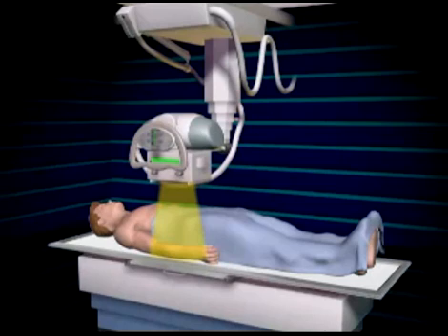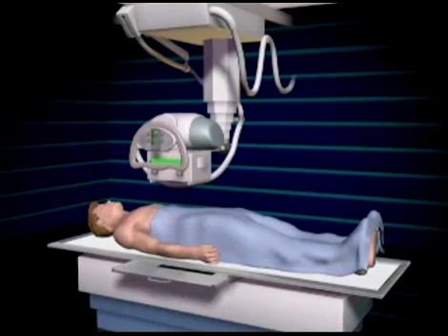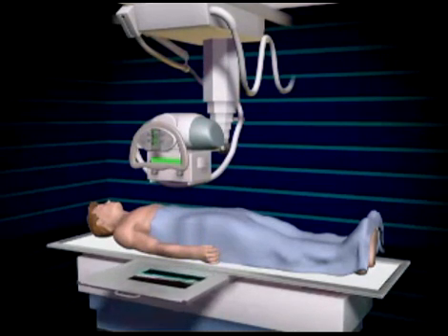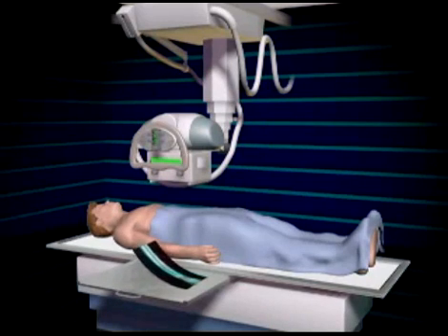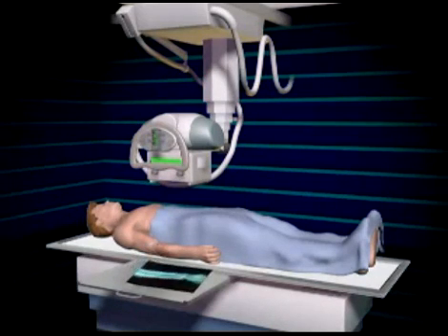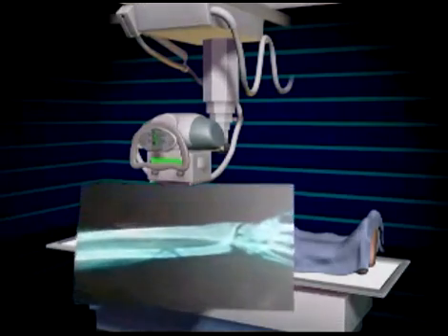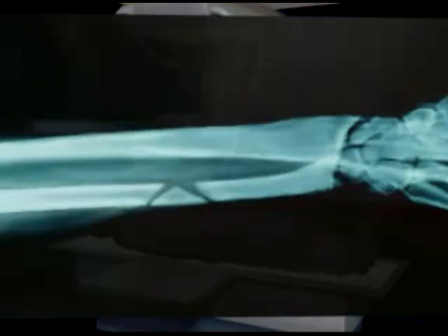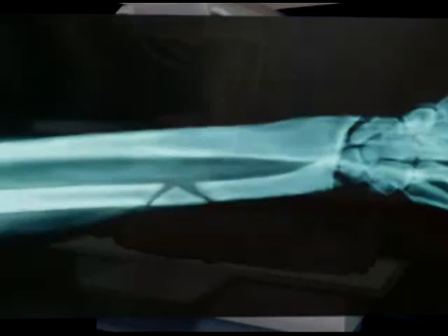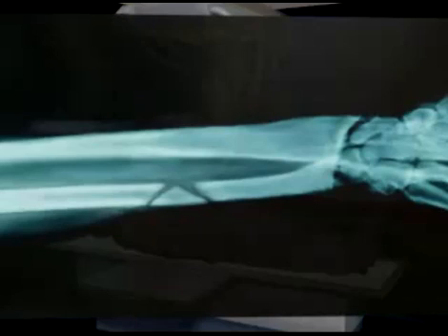As the X-ray energy passes through the patient's body, the photons of the beam reach the film and cause a chemical reaction. The areas where X-ray energy passes through the body become black, while the areas where energy is absorbed by the bones appear white. This process produces a radiographic, which is commonly referred to as an X-ray.